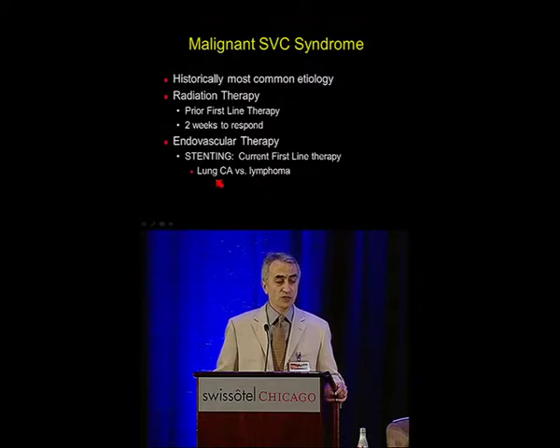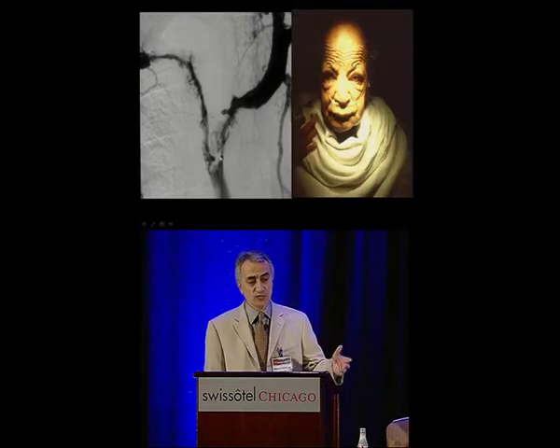I caution you in terms of diagnosis of these patients. If they have lymphoma, be careful. Lung cancer is obviously you can drill through and stent them. The lymphoma, because they respond very well to treatments, and the size of the SVC may change as the lymphoma regresses, so be careful. This is an old case.